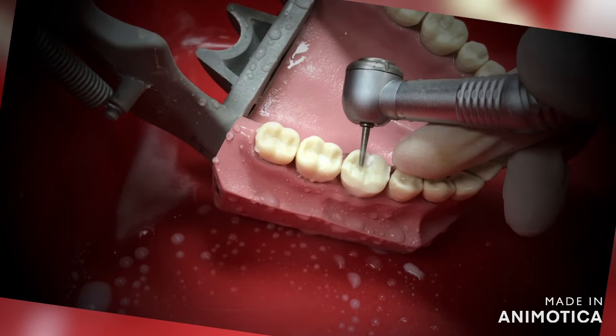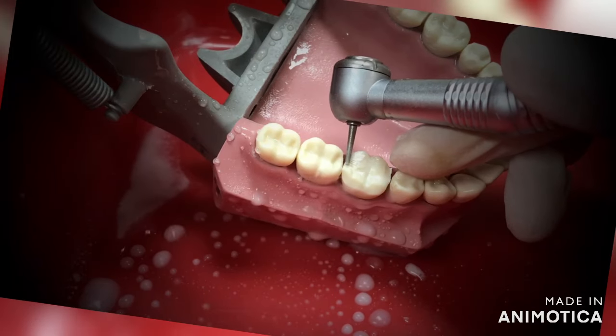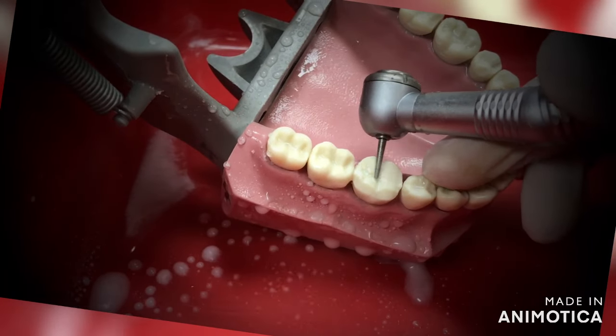Remember, this is for a monolithic crown, not for a layered one, because that will require definitely more preparation. The margin depth should be 0.8 to 1 mm circumferentially. We have used a tapered round burr for creating the margins.